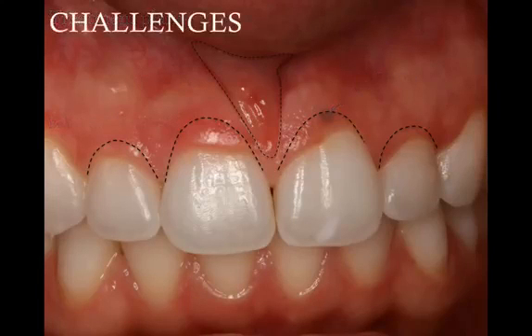And I wanted to show you some of the challenges that I'm already anticipating as part of this procedure. Number 1, once we resect the tissue on the teeth, we are very close to the frenum. So if you think about it, this is connecting to the lip. We may get a retraction of the flap. And once we perform the frenectomy, literally we are almost perforating or risking a perforation of the flap. So let's see how this was managed later on.